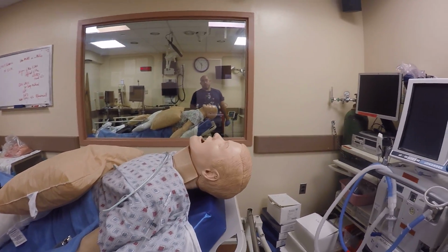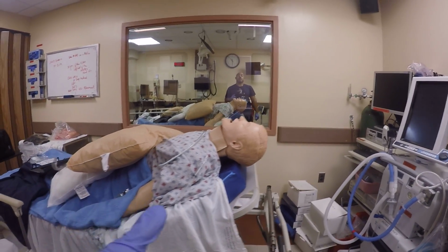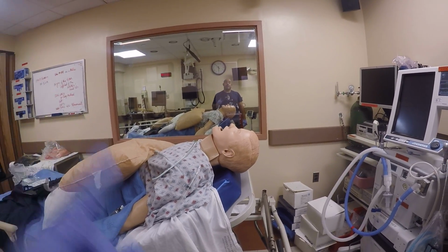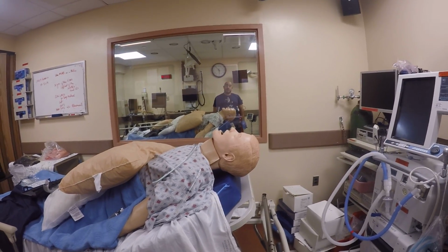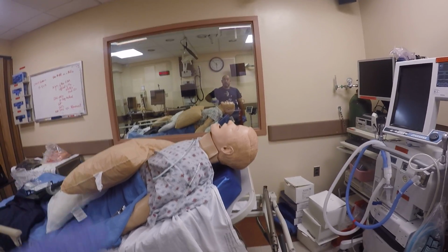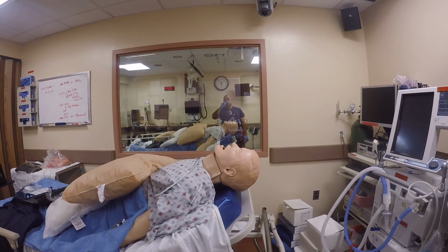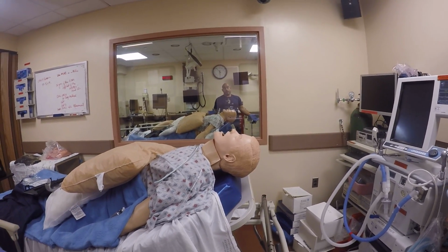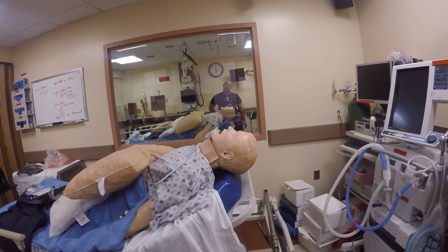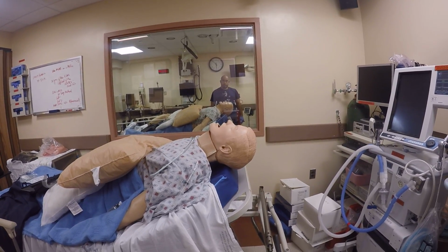I'm going to tell you, a lot of the patients that you will be intubating, if you have no problems of your own, will be those of other people that have problems with intubating. And the most common reason would be a coffin position. The patient was already placed in a coffin position, which is not ideal, because usually the coffin position, when you're doing CPR, the bed is as low as possible for your short nurses or short male nurses that happen to be either Filipino, Chinese, little people, right? It makes it easier to do CPR, but it makes it way more inconvenient for people who are taller.